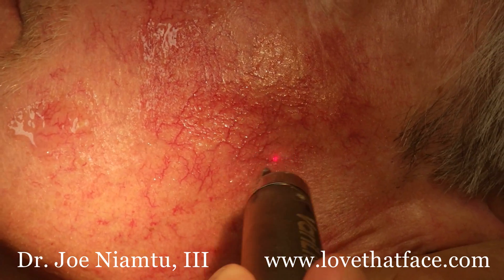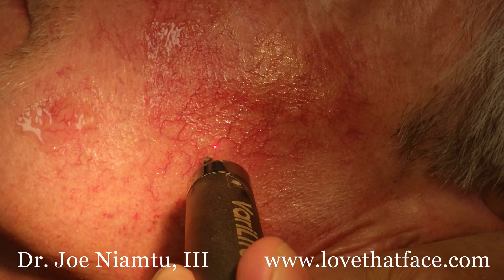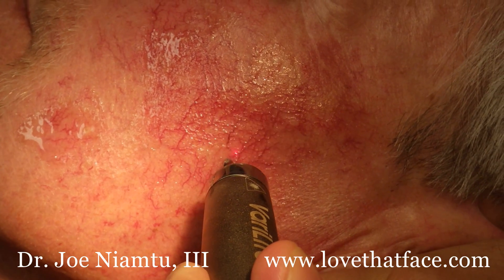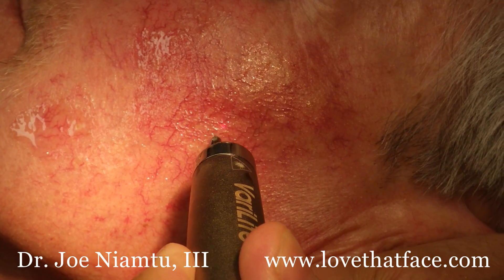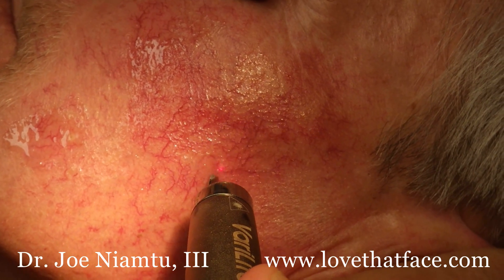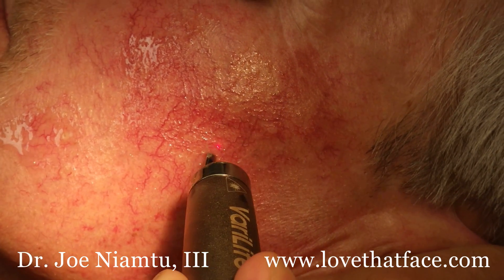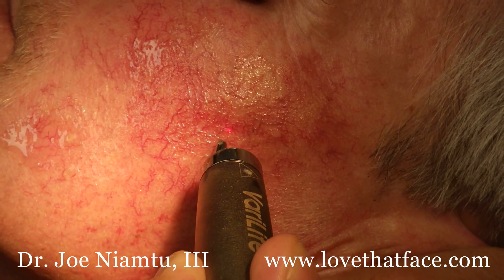We're treating some facial spider veins with the Iridex 940 laser, so we'll watch this laser just erase these veins. Although it's a simple and rather tedious procedure, I'm amazed every single time I do this that it just makes them go away.